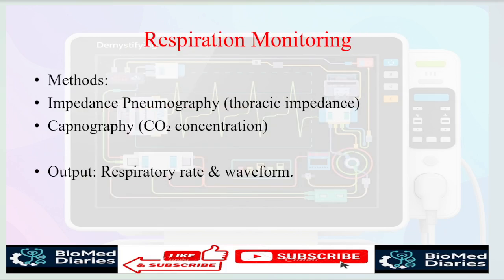So the respiration system. Respiration monitoring is another parameter for the patient monitor. The methods used in respiration monitoring are impedance, that is thoracic impedance, and capnography for the CO2 concentrations. The output is displayed in the form of respiration rate, RR, and the waveform will display on the patient monitor.